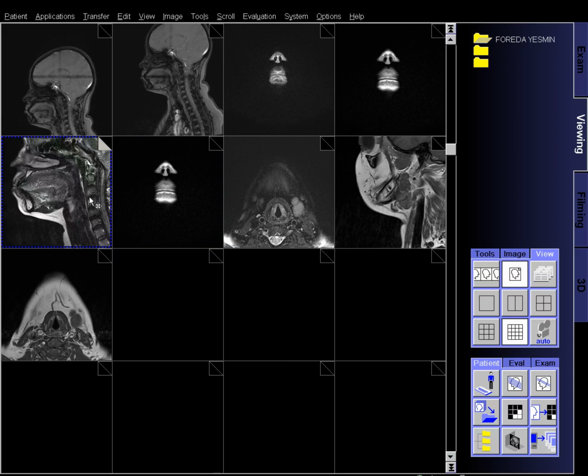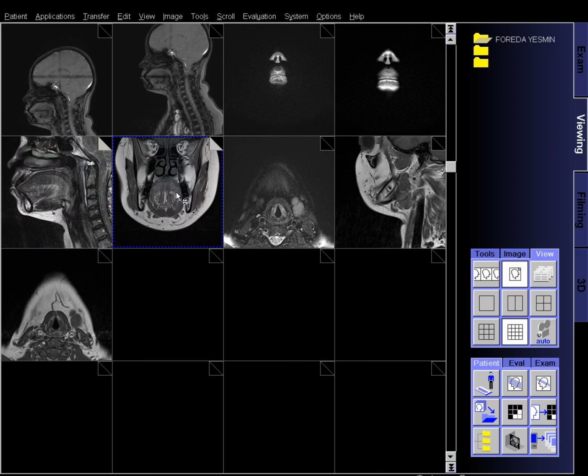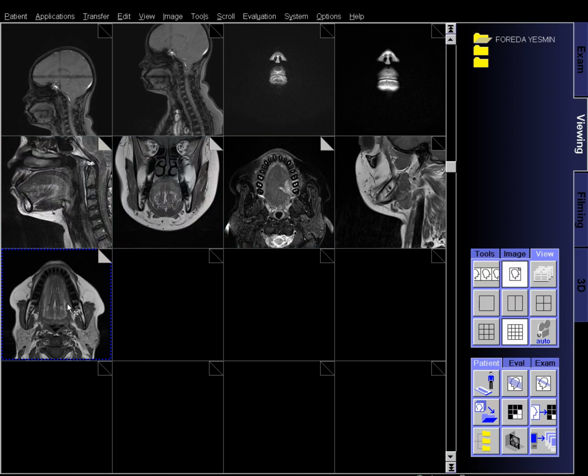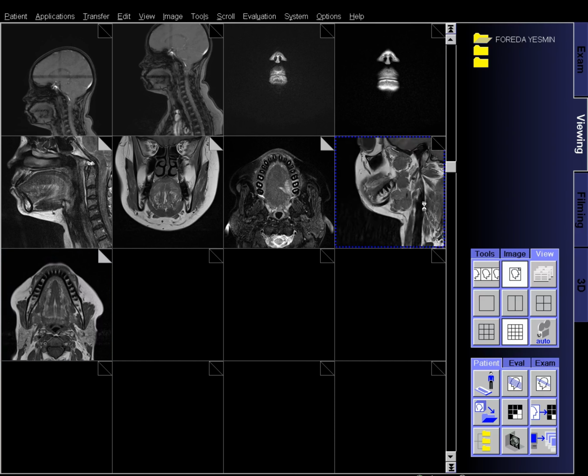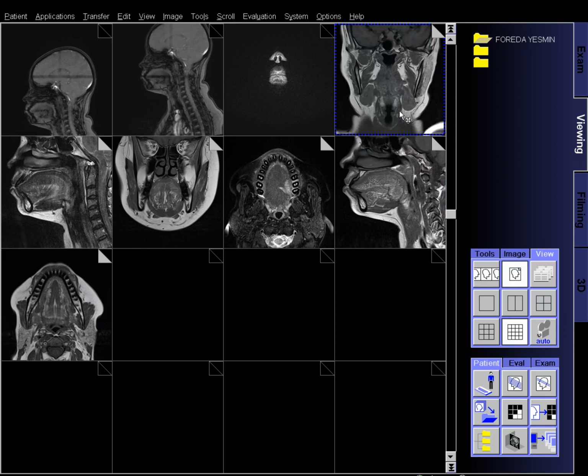Hello, everyone. Today we'll learn about MRI of the face. This scan is very important for detailed evaluation of different parts of the face, such as the sinuses, eyes, jaw, and soft tissues. So let's go step by step to understand how a face MRI is done, its purpose, preparation, and how to read the report.